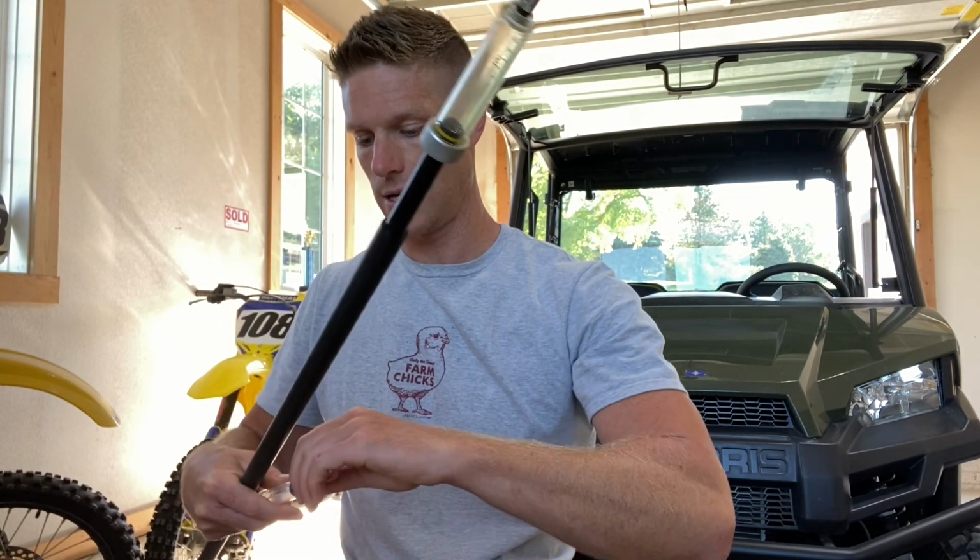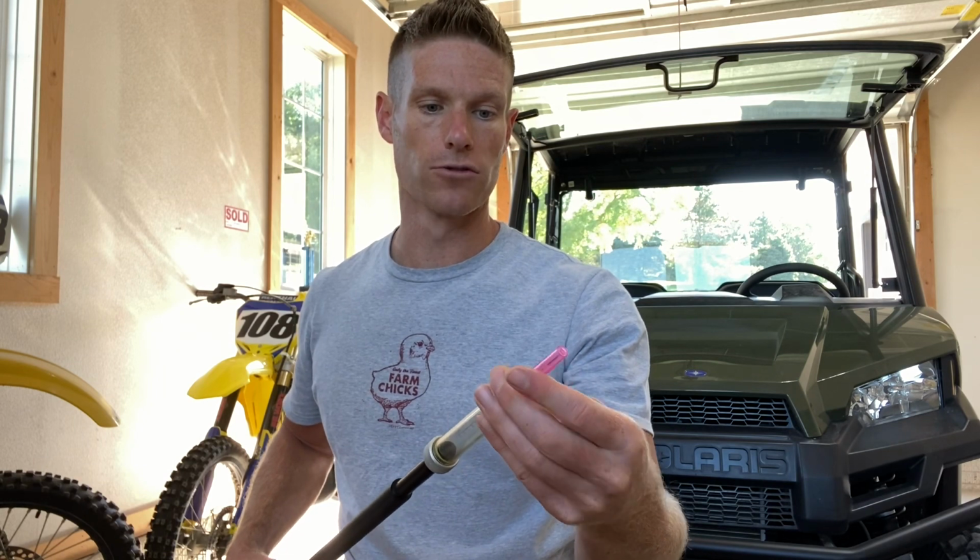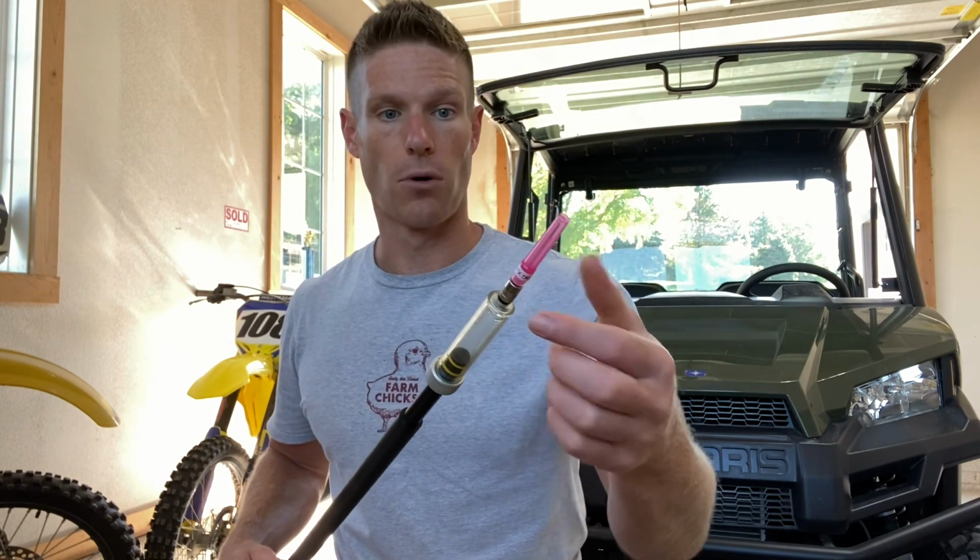Now, it's meant for smaller doses because you only have 10 cc's. That's all you get out of it, but the needle goes right on the end. This all comes apart so you can clean it all. It's fairly large. Place where the medication comes out.